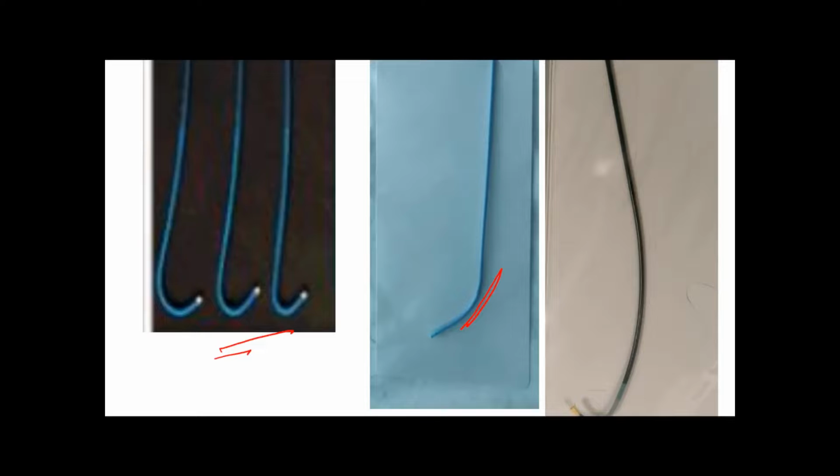It can be used for pressure measurement as well as intubation of various coronaries, because it can be manipulated to different shapes in the aorta.